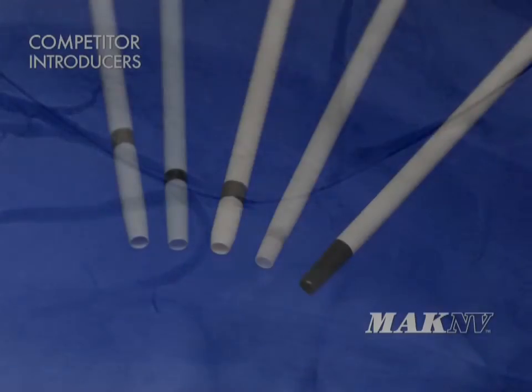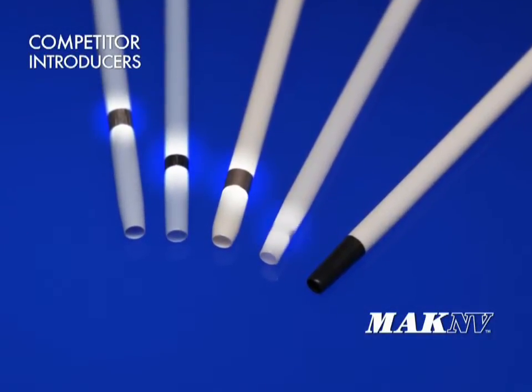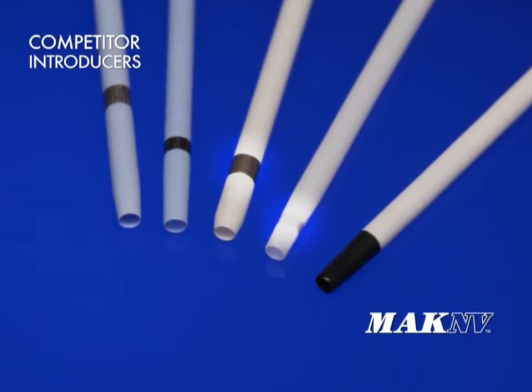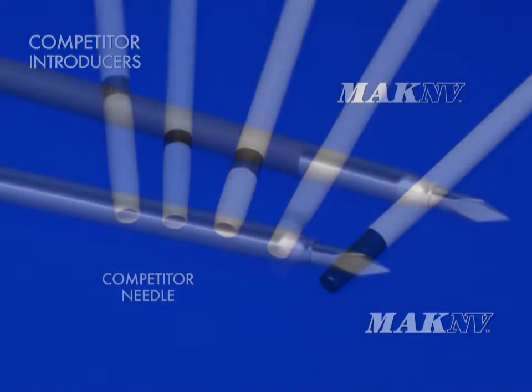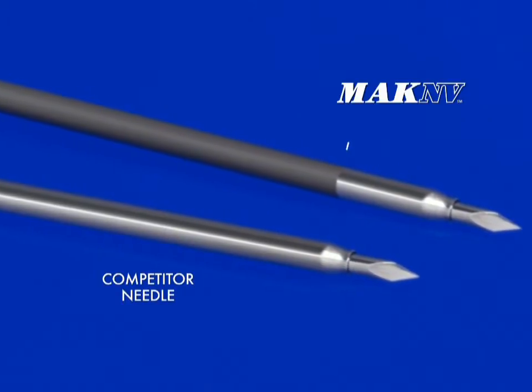The tapered tip of the MacNV introducer is made from a radio opaque material that provides enhanced visibility for determining the exact location of the introducer tip. Other introducer systems have radio opaque markers proximal to the introducer tip, which may make precise location difficult to determine.